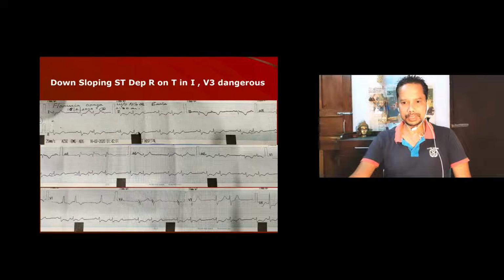Now you see in this ECG there are a lot of ectopics. So you see this is P wave, R wave. Now if I say find the axis, this ECG I know we had discussed last time, it was difficult to comment on the axis, but this is an isoelectric complex, and this is also sort of an isoelectric complex.